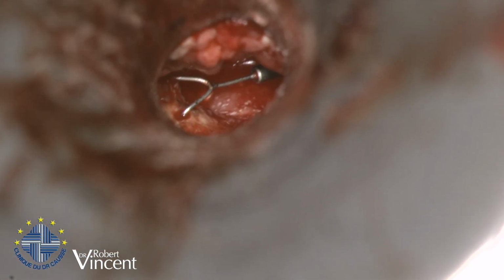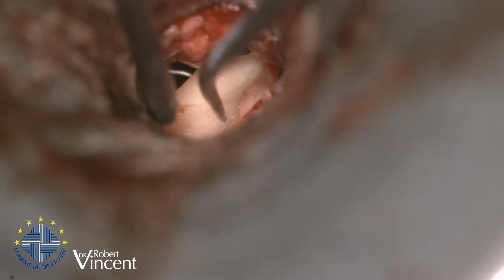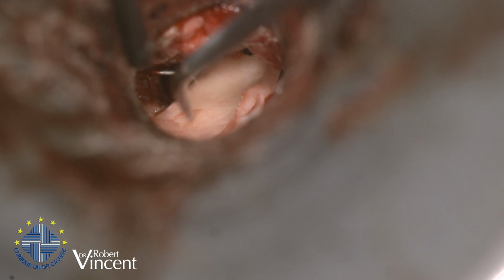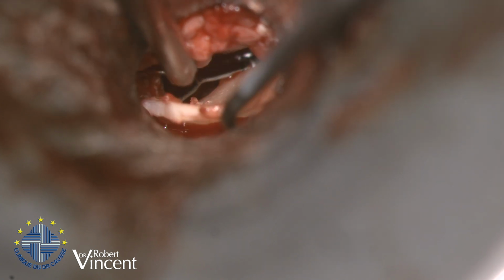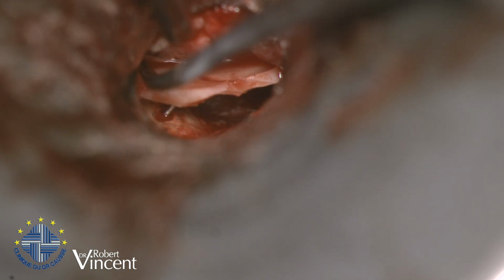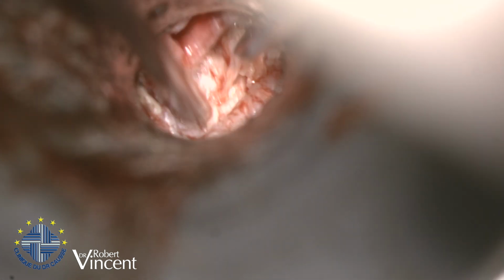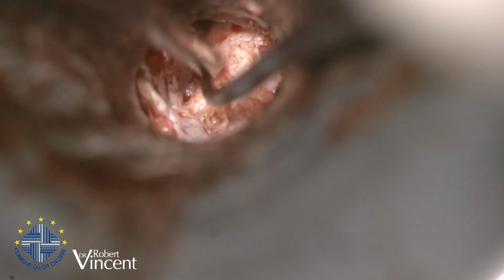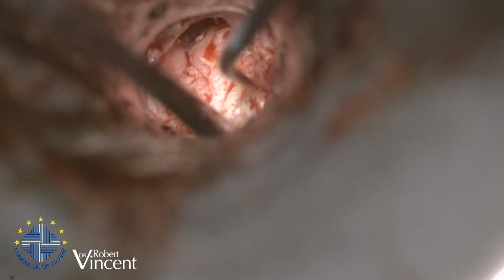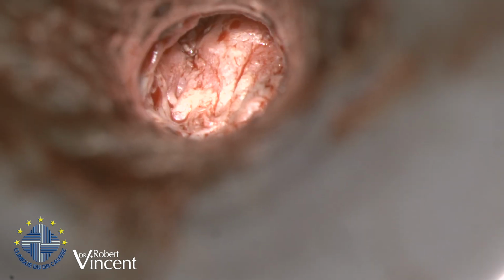So, okay. Ah, it's coming well. Looks like I did this before. I think sometimes. Yeah, fits well. Okay, good. Well, you never know, eh? Because sometimes you size it and it's too short or too long, then you have to resize it. Okay, I think it's fine.